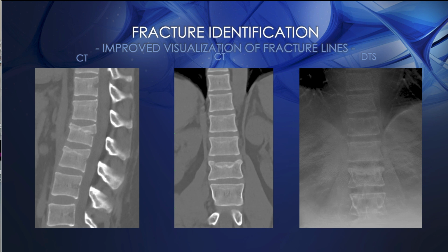And it also illustrates how having familiarity with looking at the images matters. There's a misconception that just because you read CT and you read radiography, you should be able to read tomosynthesis. Yes, those skills help you, but it's a totally different modality, which speaks to its strength in showing us things that those other 2 modalities don't, and also underscores why there should be a focus on education and training in this modality, because it's worth it. There really is a lot to offer.